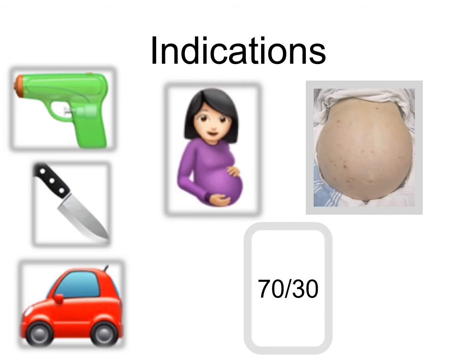So you're going to learn about the RUSH exam at some point. It's one of the critical parts of that. So it really has a lot of applications now outside of the traumatic abdomen, but we still mostly talk about it in the context of trauma.